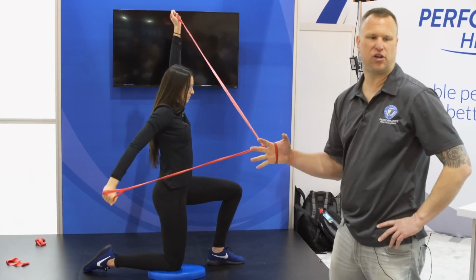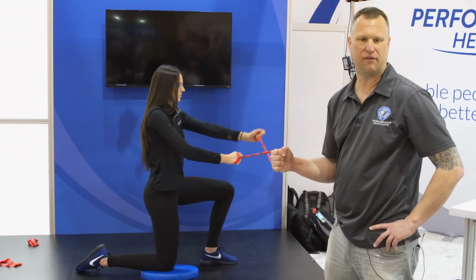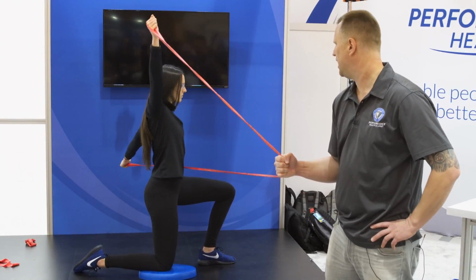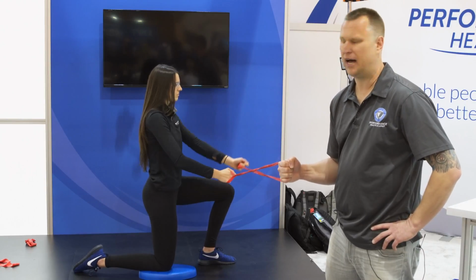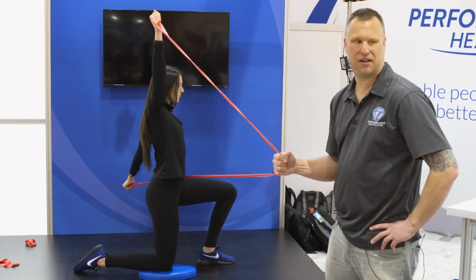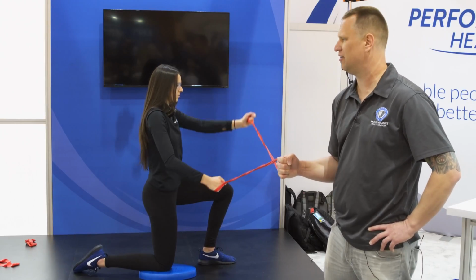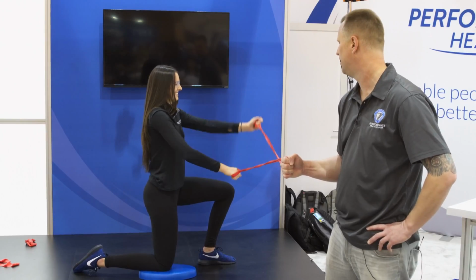So this would be secured either by the therapist in the clinic, or if you have the ability to have an anchor to like a CLX wall station, this could be set up here, and the patient is working on opposites, extensions with the upper core. But I would encourage you guys to maybe consider trying this one time. Her hip right now is screaming. Her legs are screaming, her hips are screaming, and so forth. She's getting quite a bit of workout through that hip.